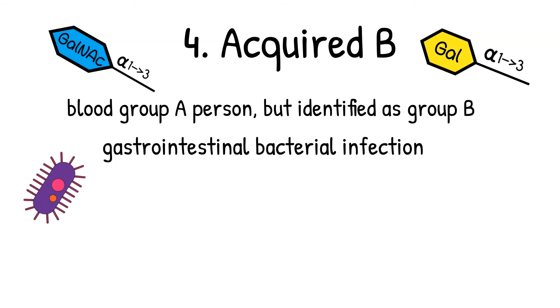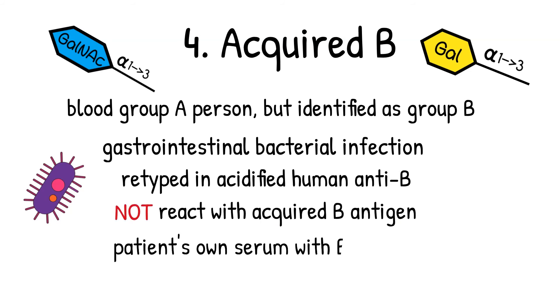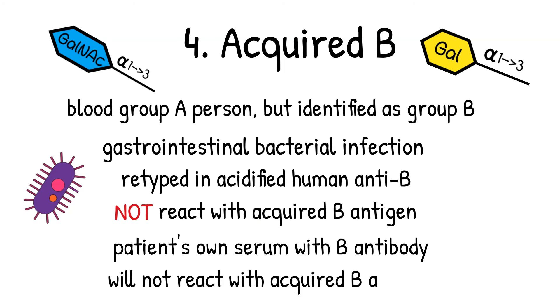The acquired B phenotype shows strong agglutination with anti-AB and weak agglutination with monoclonal anti-B. Solve this problem by retyping using acidified human anti-B. Acidified human anti-B does not react with acquired B antigens. Also test the patient's serum with their own red blood cells because the patient's own anti-B will not react with the acquired B antigens on their own red blood cells. If you want to know more about acquired B, please feel free to let me know in the comment down below.